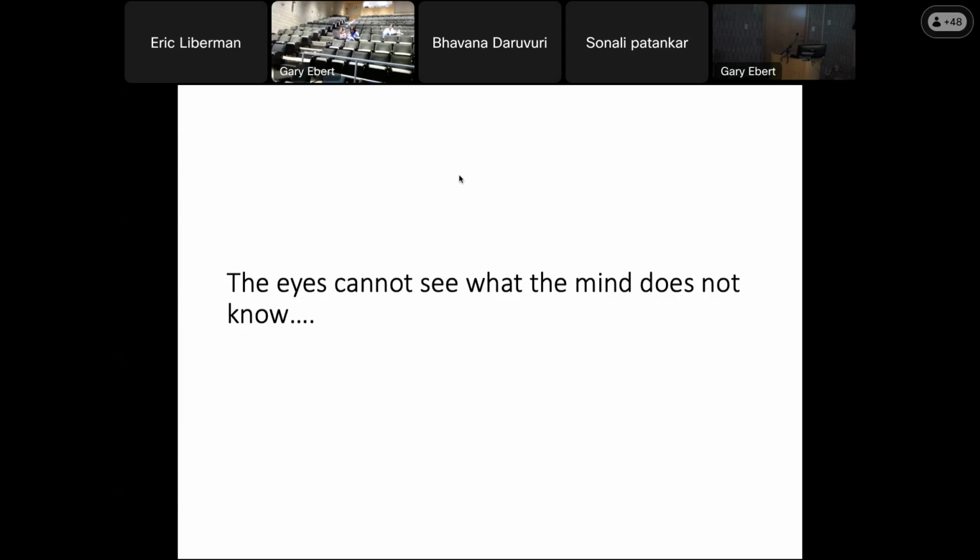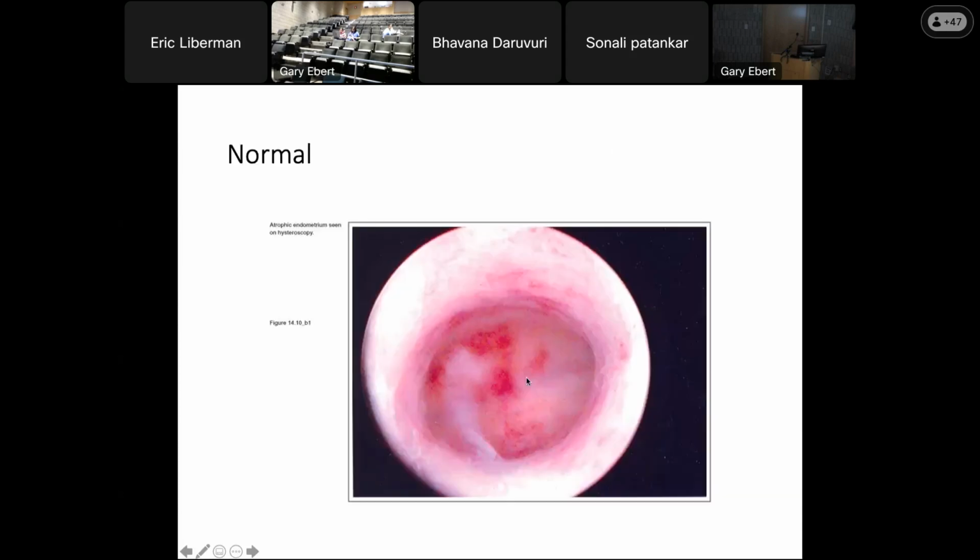So now when you're doing the hysteroscopy, one of my mentors once told me, the eyes cannot see what the mind does not know. Dr. Stevenson probably knows who I'm referring to. But this is true. So first you need to know the normal so you can understand or appreciate the abnormal.